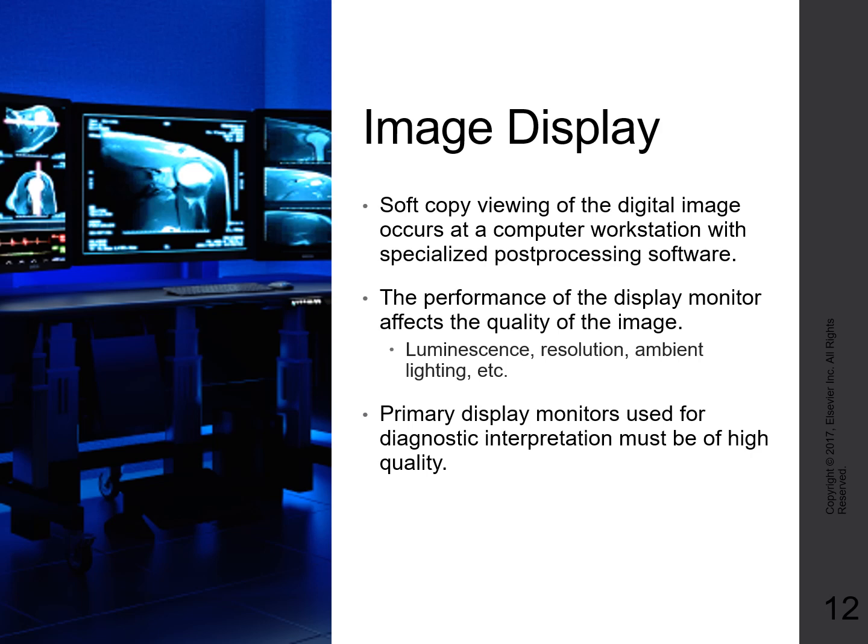So when we refer to soft copy viewing, that means that our display is digital. If you ever hear somebody say hard copy, that would mean that they actually have a physical printout or film that they're reviewing. Our digital image displays are always going to be referred to as soft copy.